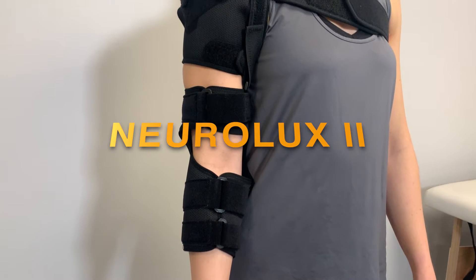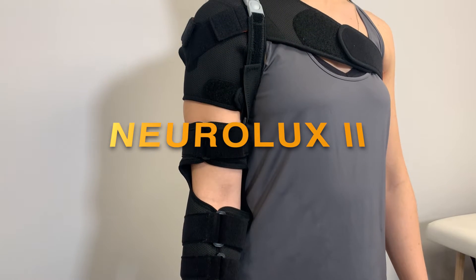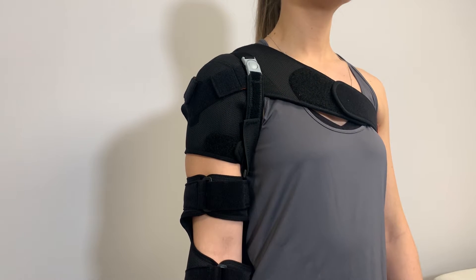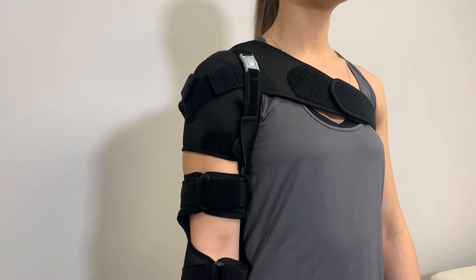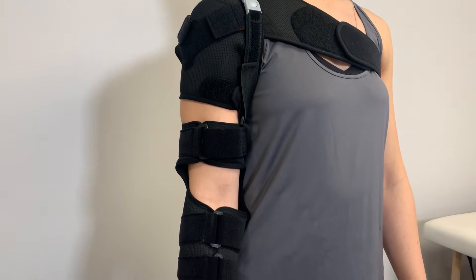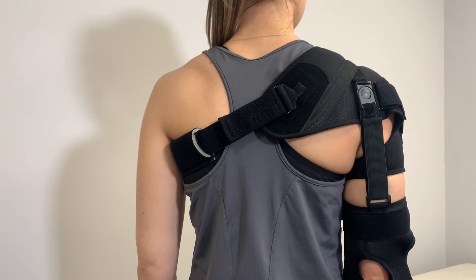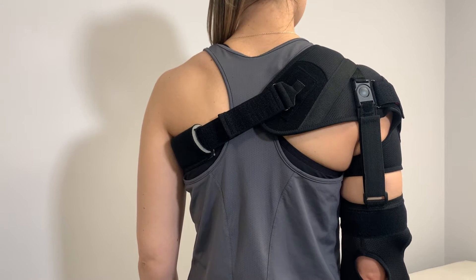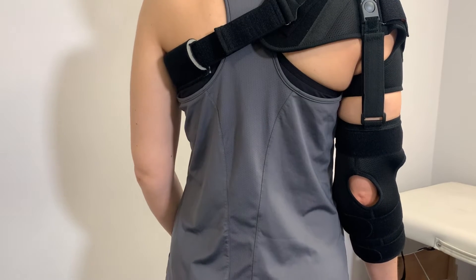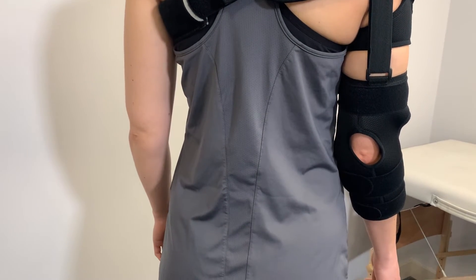The Neuralux 2 is a functional shoulder brace for stabilisation and pain management of the shoulder joint in cases of flaccid paralysis after a stroke. The brace enables the repositioning of the humeral head in the shoulder socket, reducing shoulder pain and preventing secondary damage to the articular capsule, tendons, muscles or nerves, and helps to prevent shoulder hand syndrome.